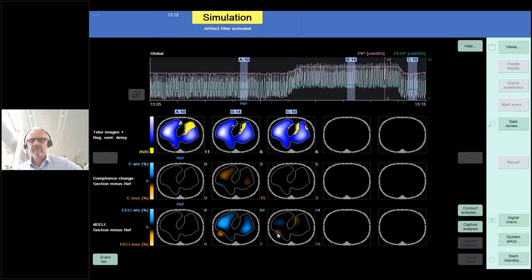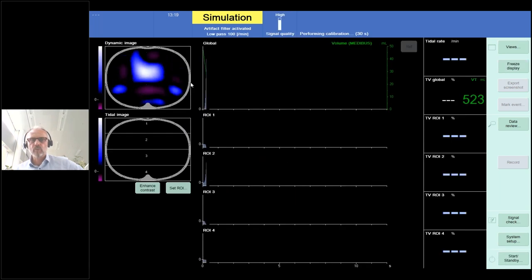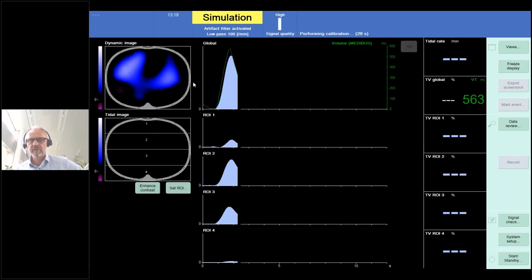So in this part, even though we have only elevated the PEEP by 4, we could say it's not enough. But in this example, I can demonstrate why we do not see any benefits in this particular patient. So it's another example for a non-recruiter. However, in contrast to the first one where the lung was fully opened, here the lung is not fully opened. And I will show you why this patient was a non-recruiter.